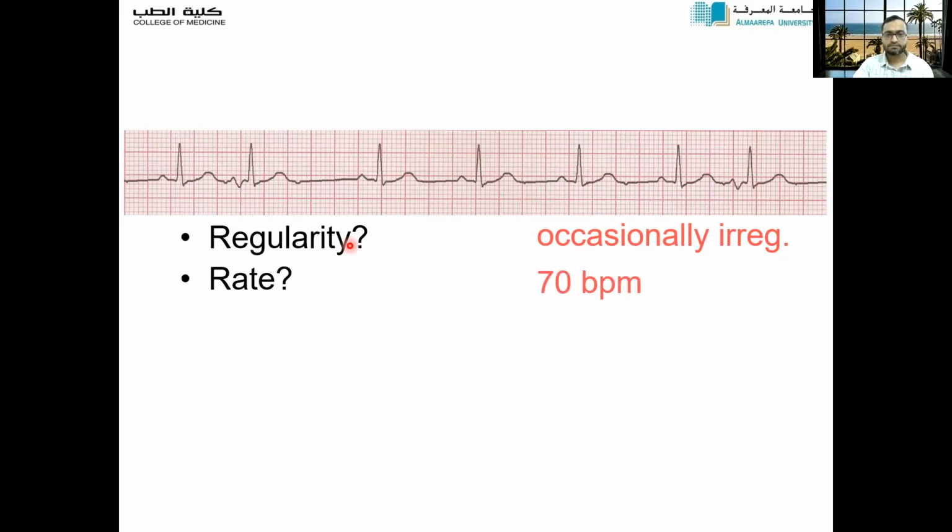Heart rate, normal. P waves: the second and the 7th P wave are different in shape or contour. You see the first P wave, look at the second P wave, how it looks. Different in shape, it's biphasic, with a positive component and a negative component. This is normal, this is normal, this is normal, this is normal. Again, the 7th one, same. It's different in shape.